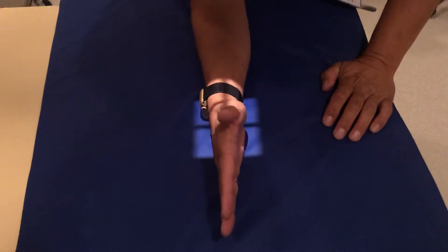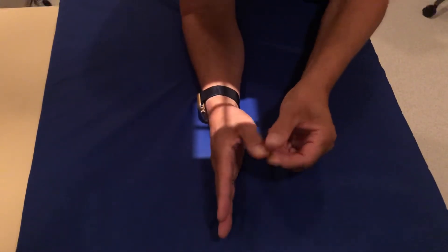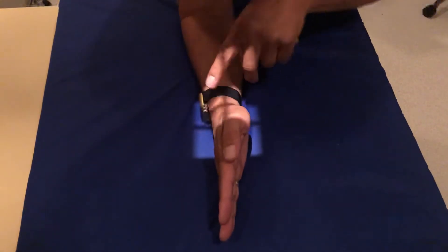The third view is going to be a lateral — a true lateral, just like that. You can keep your thumb here or off to the side, but this is going to be straight up and down, a true lateral view.